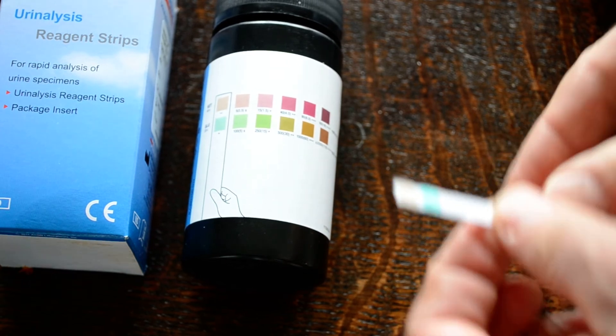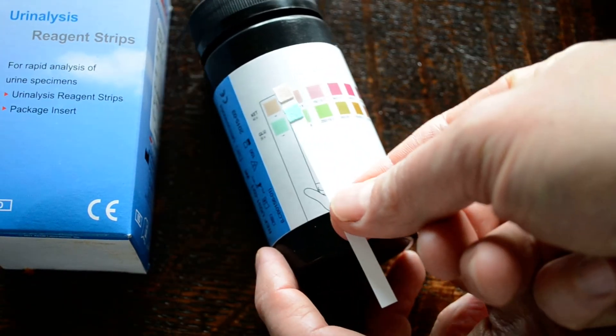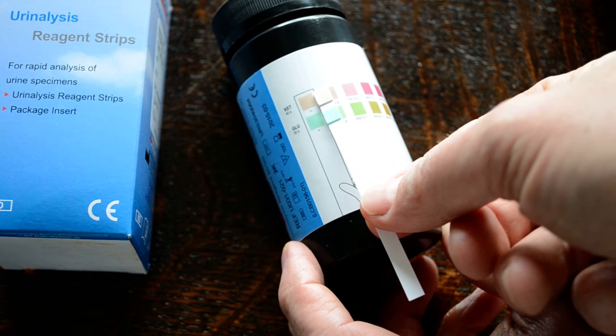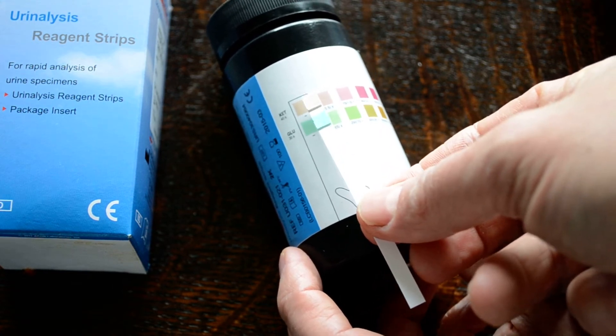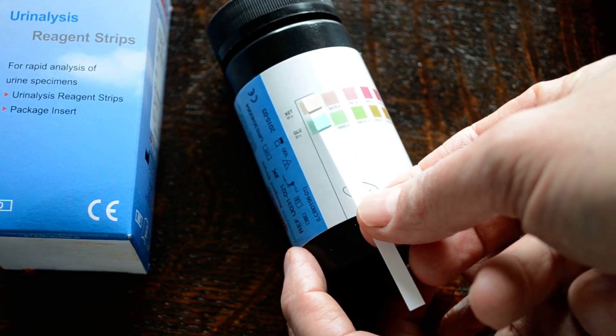If I show you this test strip, you'll see that in its fresh dry format the colors on the two pads — top one ketone, bottom one glucose — correspond with the all-negative results for both.